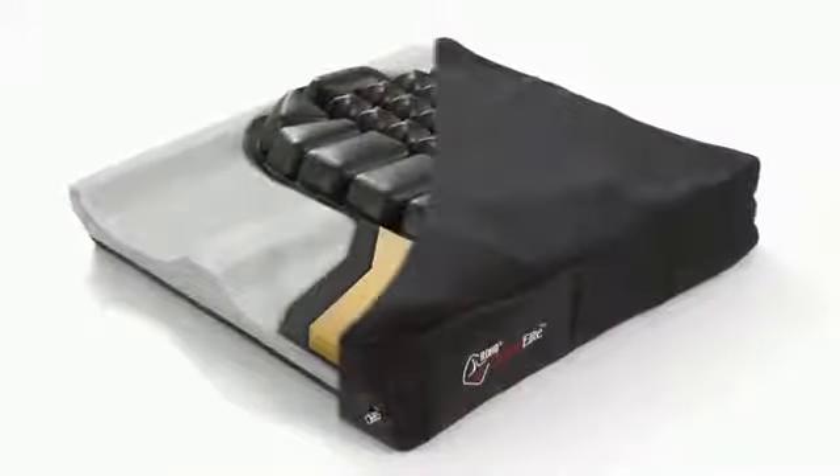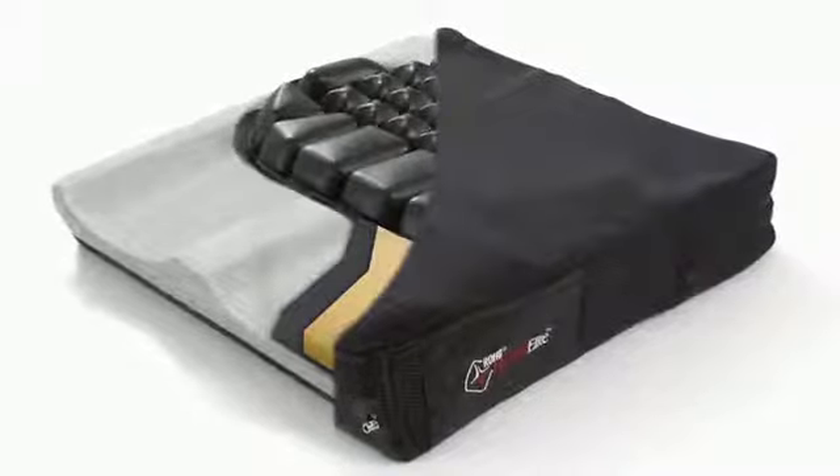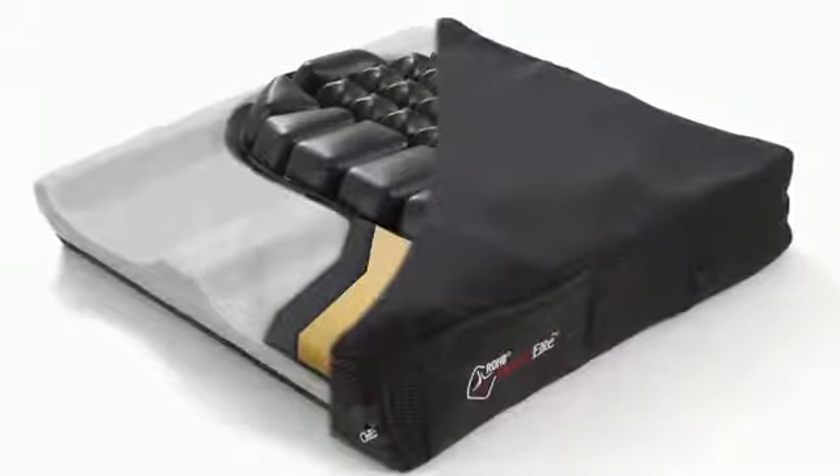The cushion is a hybrid product, combining the skin protection and shape matching ability of the Roho Dry Flotation Technology with the stability of J-Base Technology. The Hybrid Elite is available with either a single or dual valve Roho Air Insert.